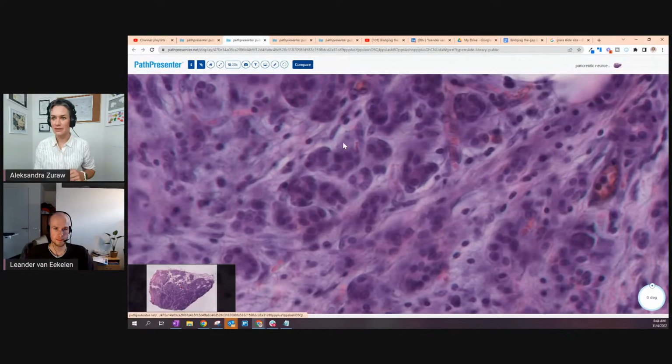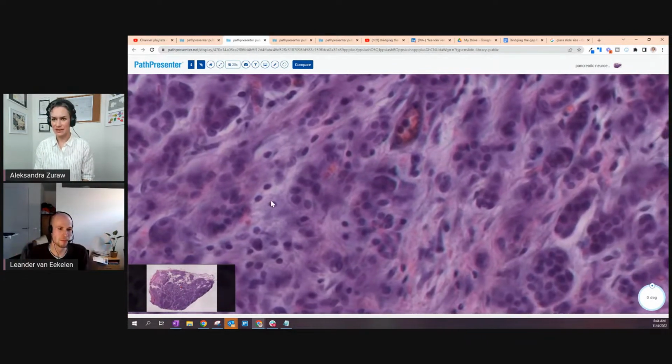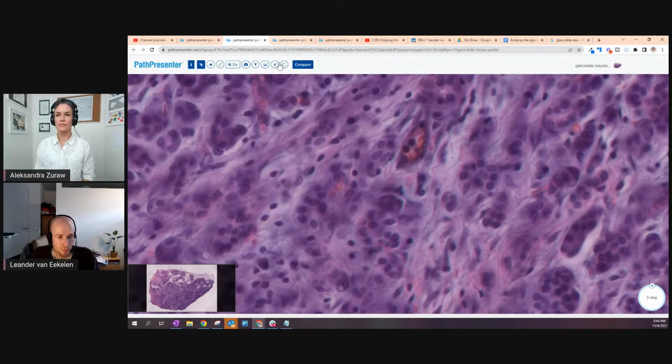And I think at this point it's good to contrast it with some other tasks. For example, why might I not do something called segmentation? Yes. Let me clear my annotation here. And no, I don't have a PD-L1, sorry. Let's find a nice nucleus. Yeah, here these guys are nice. So with segmentation in general, instead of doing an XY prediction of where something is, we are actually trying to describe pixel-wise where an object is and what its spatial extent is. Spatial extent is the keyword. So basically, what shape is it actually, and where is the complete object? If you were to think again in terms of pixels, ideally, and this doesn't always happen, of course, you have a method that's capable of saying, per pixel, this pixel belongs to this object, and this pixel belongs to that object, and so on.